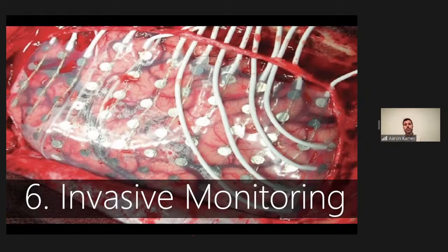And they can also place what they call depth electrodes, where they're putting EEG leads deep within the brain, often in the regions of the hippocampus or other potential suspicious areas. They will place these leads and then have the patient undergo in-hospital monitoring.